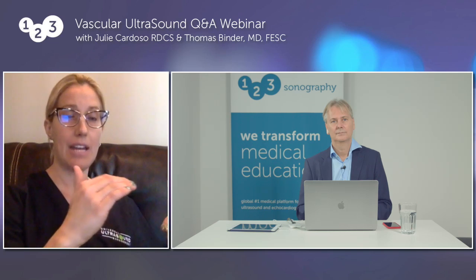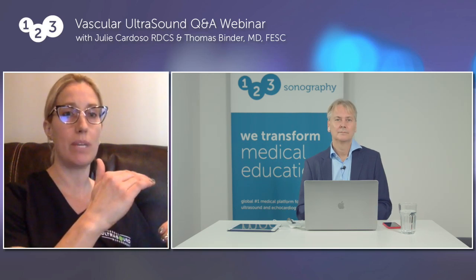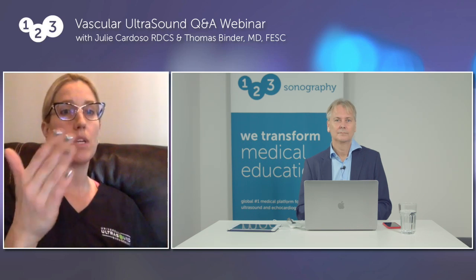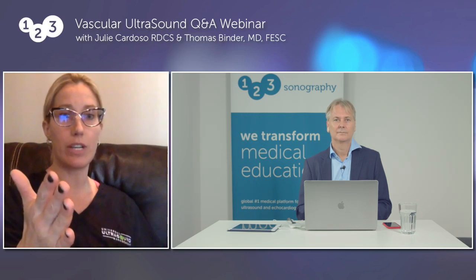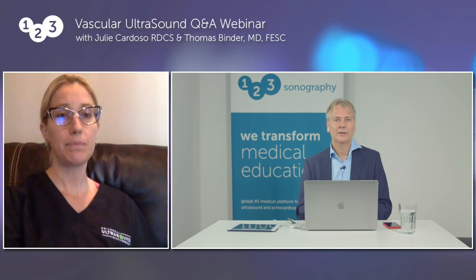A true reflux waveform is flow above the baseline, depending upon which direction you're insonating, and there will be nothing underneath it. So you'll have your augmentation of your waveform, which should be set below the baseline, and then the insufficiency above the baseline, and it will be a good, clear spectral window. And again, you can use the knobology, another feature being the wall filter. If you decrease or increase your wall filter, it brings out this waveform really nicely.